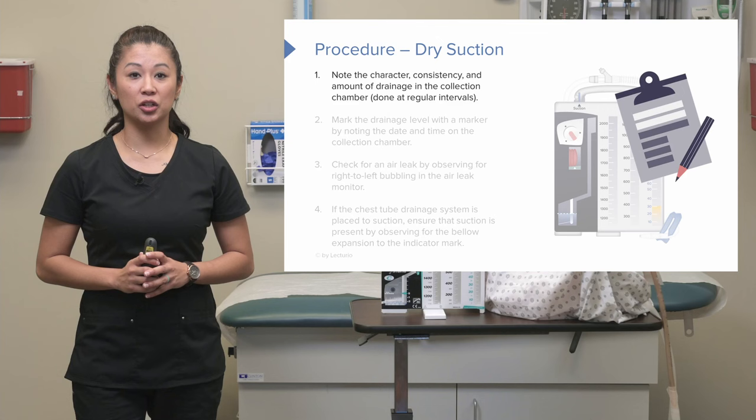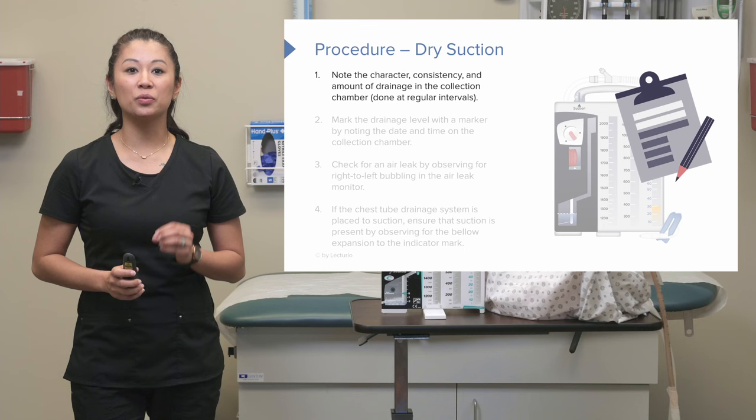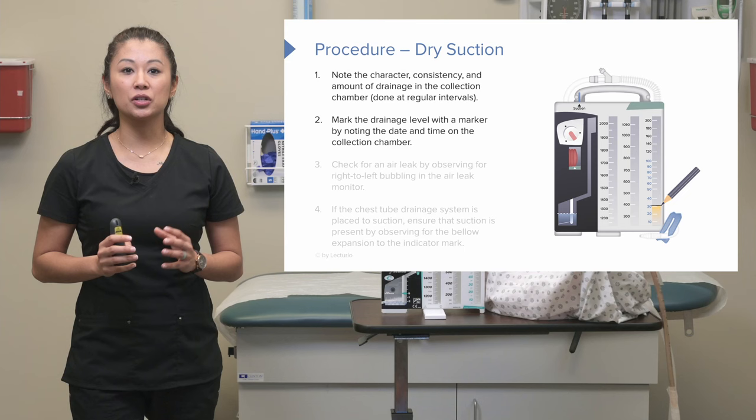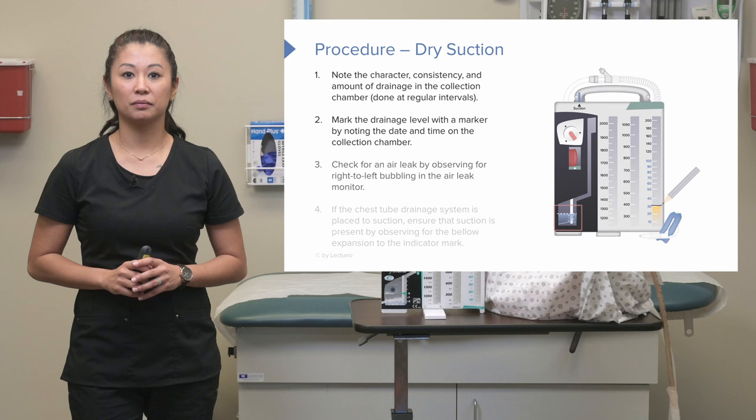We just talked about wet suction monitoring — now let's take a look at the dry suction system. Just as before, we're going to note the character, consistency, and amount of drainage in the collection chamber. This needs to be done each shift and at regular intervals. We can mark the drainage level with a marker, noting the date and time on the collection chamber itself.